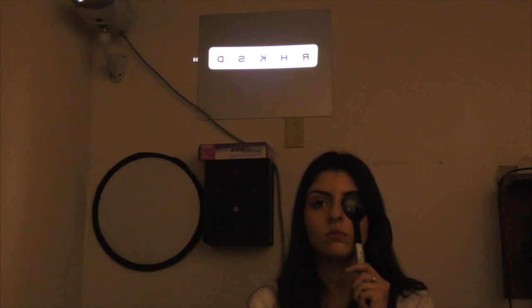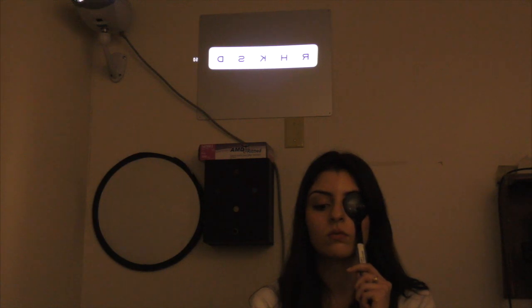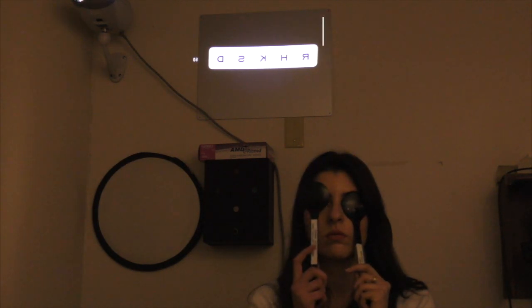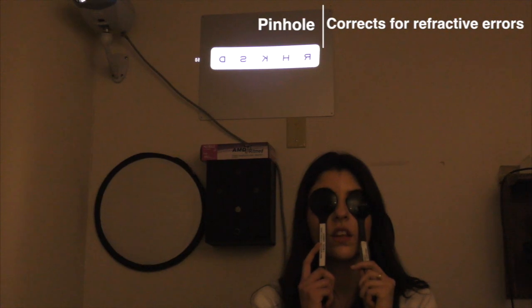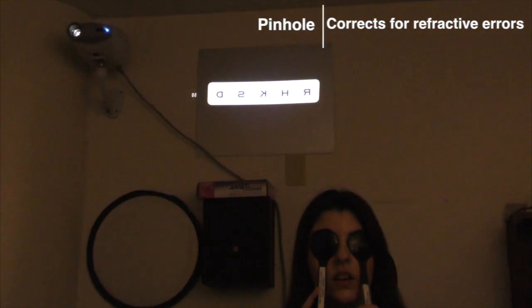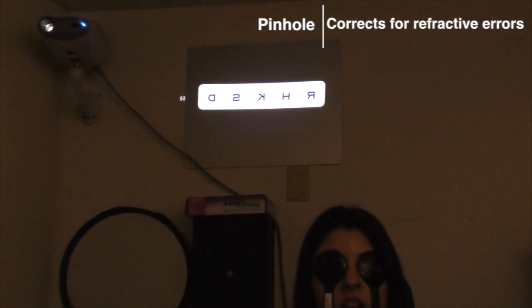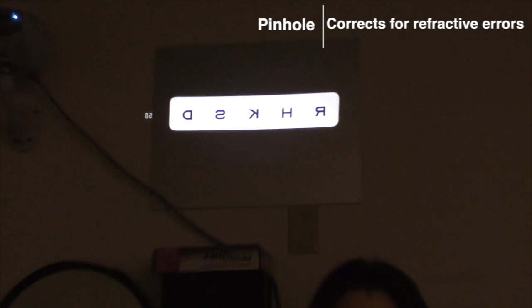Now we're going to try the pinhole to see if it corrects for refractive errors. Can you please look through the pinhole occluder with the small holes? Look through any hole and tell me if you can see the letters now. Yes. R, H, K, S, D. Very good.